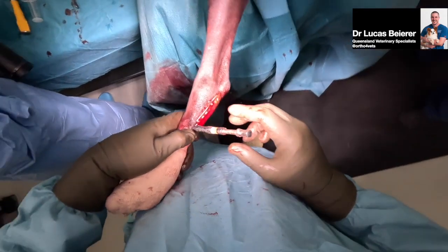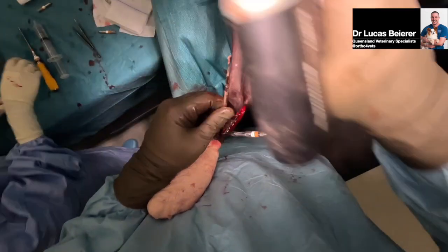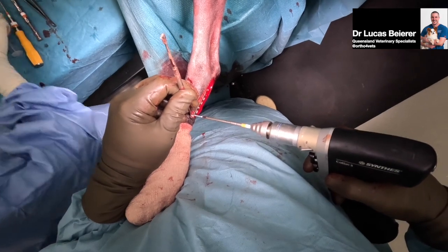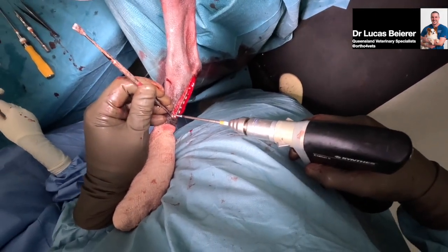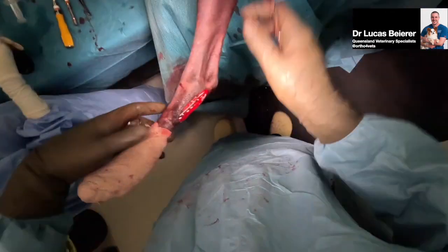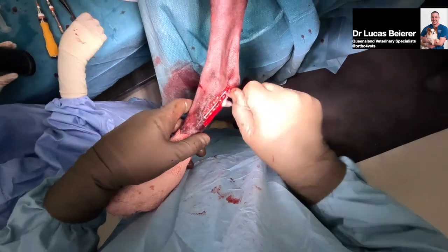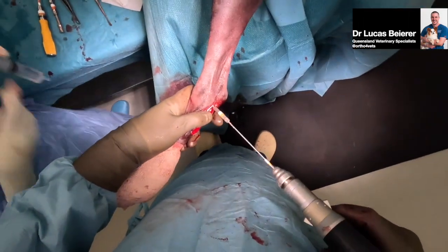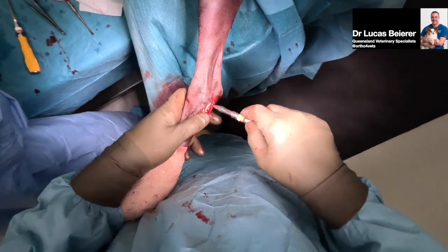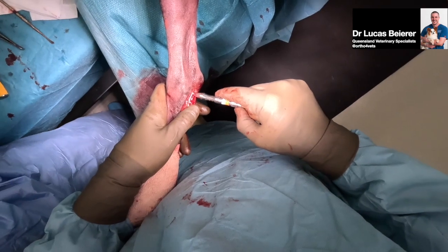Go an 18 locking screw. Depth gauge. Straight, which is good. Just lock a few at the top and a few at the bottom and call it quits. Good. Thanks, guys. That's your last time, I think. So that one's in the mid proximal part of the calcaneus there. Put a 14, I think.